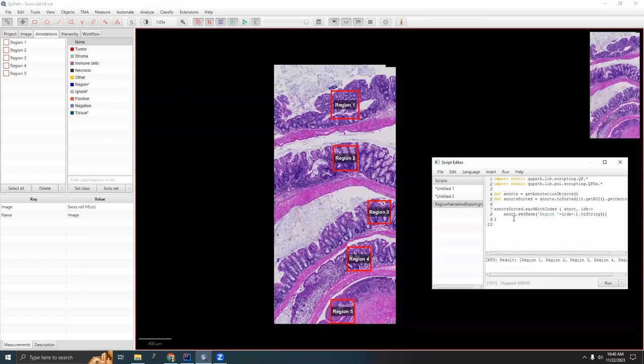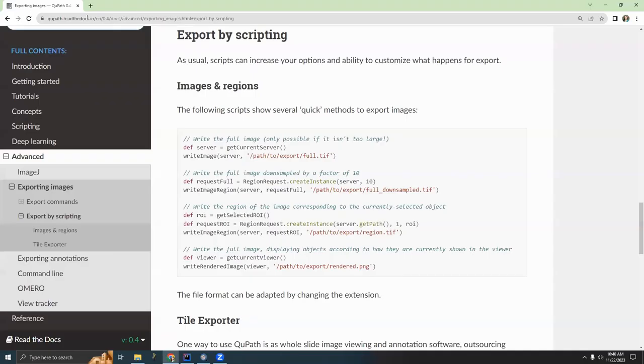The best reference I've found is actually the read the docs document. So if you go to qpath.readthedocs.io and search export by scripting, it gives you some example scripts. The first one writes the full image, which is not what we want. The next two write only the image region, which is what we want.